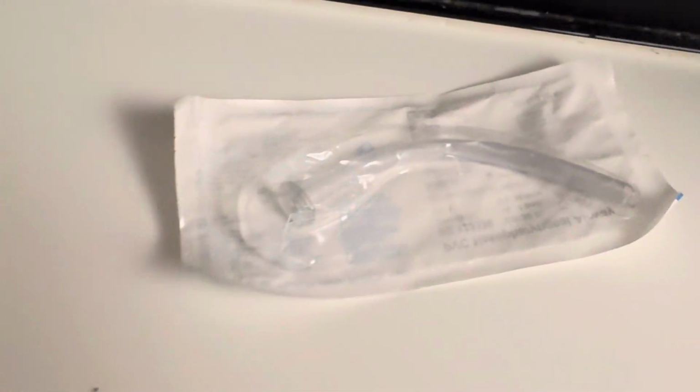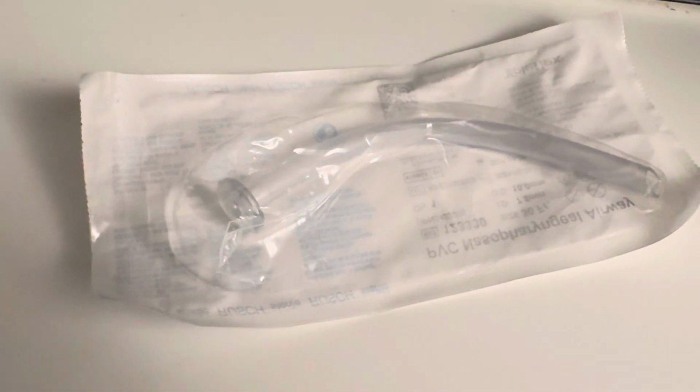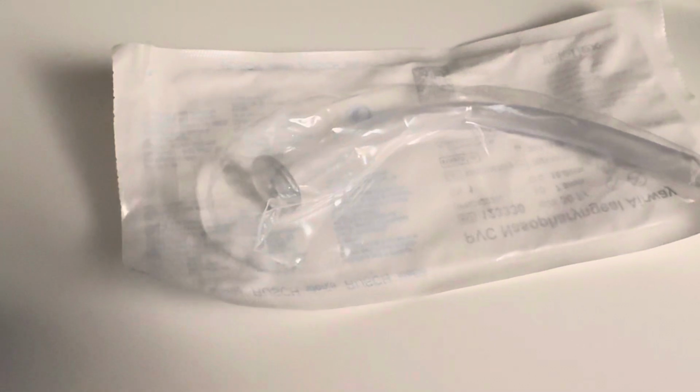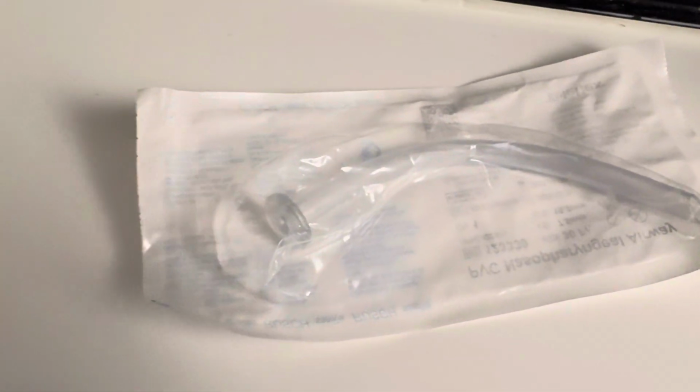When I have somewhat measured along the patient's airway, you can probably gauge whether the patient has big nares or smaller nares, but this is to facilitate frequent suction. Sometimes our patients are unable to clear their secretions on their own, and we have to give them nasotracheal suctioning. We go through the nares into the trachea, down towards the lungs, to suction a patient who needs frequent suctioning.